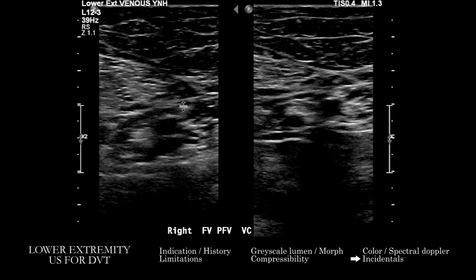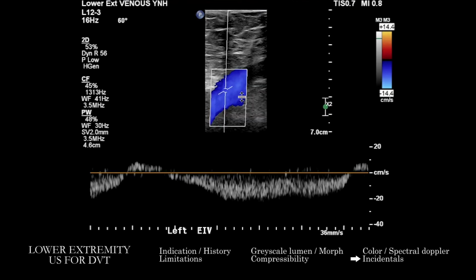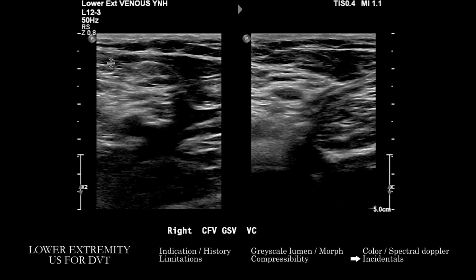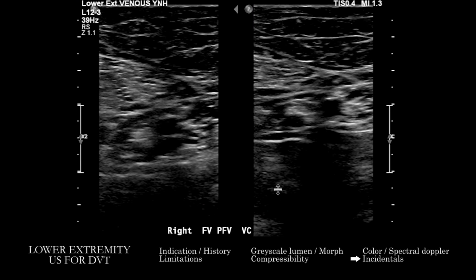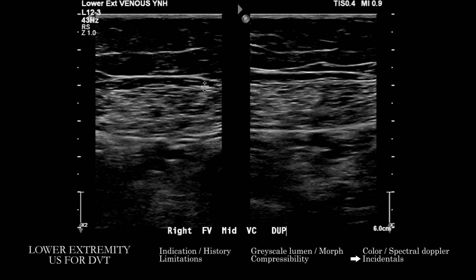An important thing, for basically every study, but in particular when the clinical scenario is not very typical of DVT, you want to make sure that you're looking at all of the incidentally imaged soft tissue, muscular, even arterial anatomy, subcutaneous tissue. If we're seeing something incidental in the subcutaneous or other tissues, you want to guide your technologist or your sonographer, or if you're scanning yourself, to do a more dedicated exam in that area.